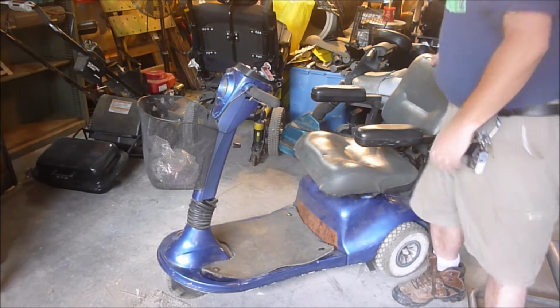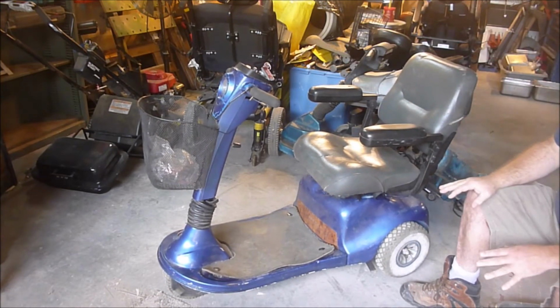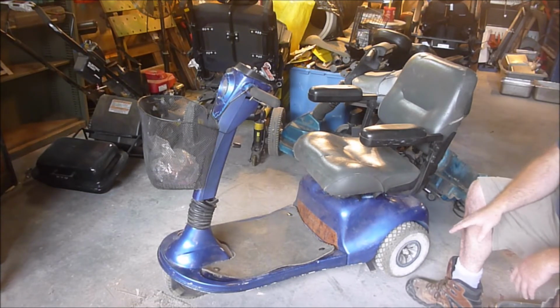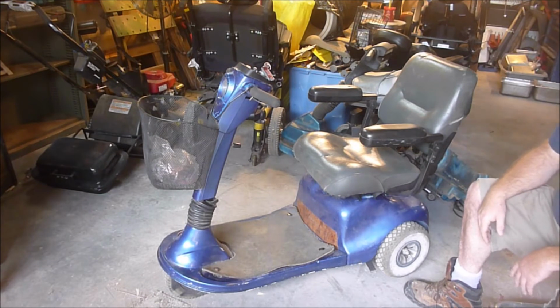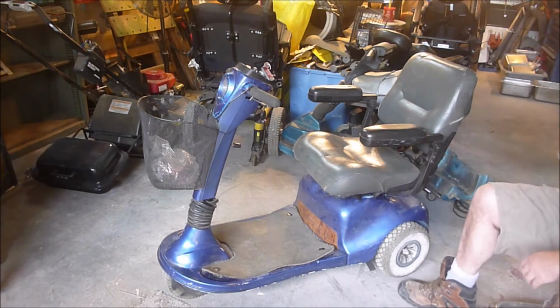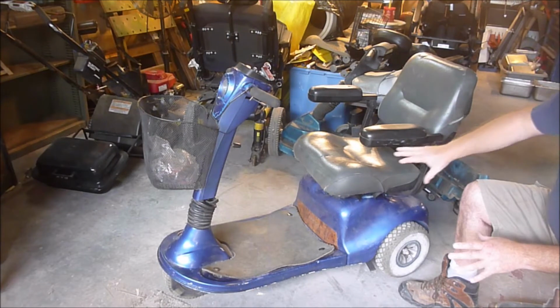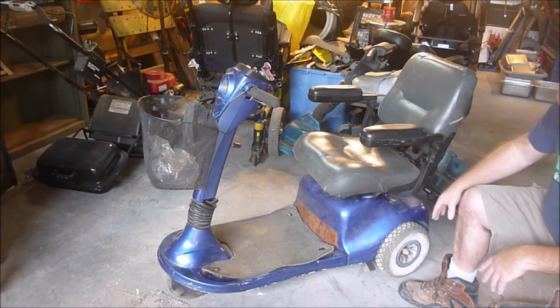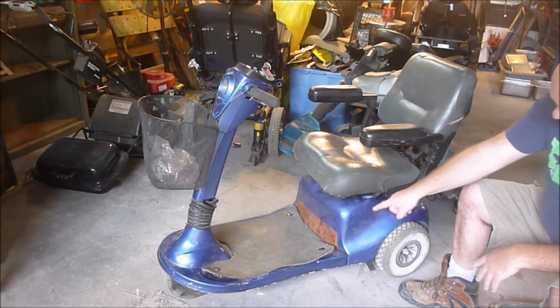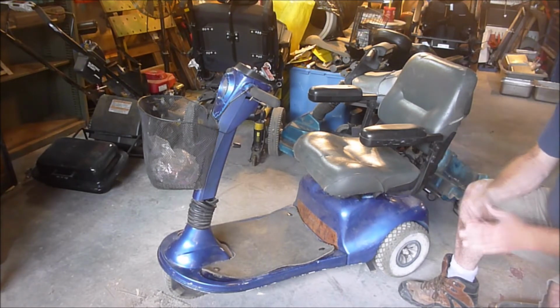Honestly, when I bought this, it was in a lot better shape because I take this thing camping, down some dirt roads and things, to the point where I have actually bent the axle on this one. But the reason I bought this one was because if you take the seat off and the batteries out of it, which are fairly simple to do, then you pull up in the middle and there's a couple latches, and this whole thing will fold down and fit in the back of a trunk.